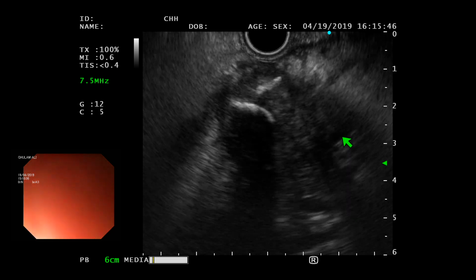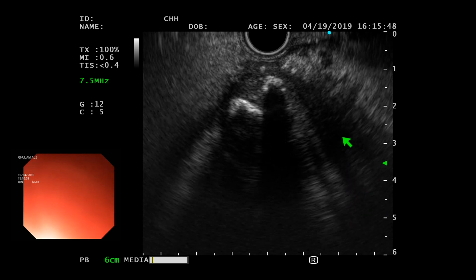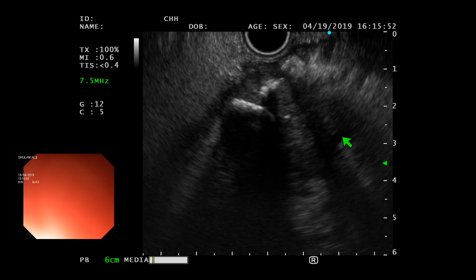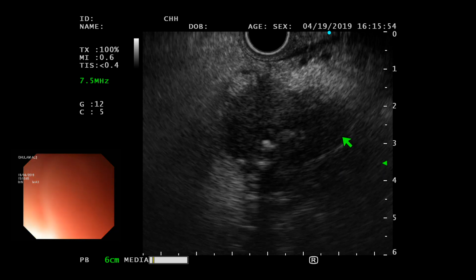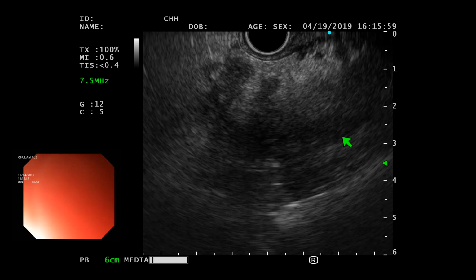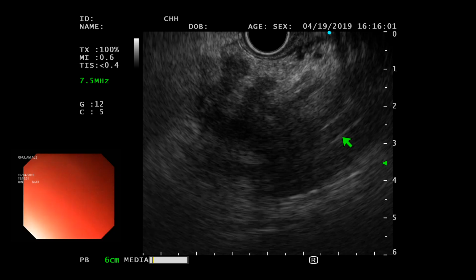Go to the left. And let's go towards the neck of the pancreas now, because we saw the tail area. The neck is the other way. We'll go that way. Okay. Good. Big wheel towards you, because it's a little bit down now. To approximate, you have to move the big wheel towards you. Okay. So here.